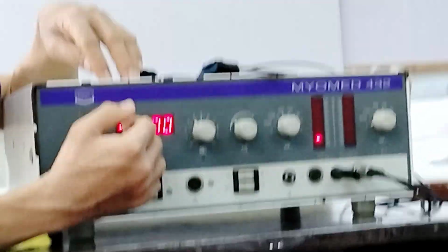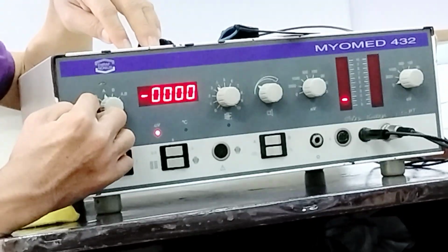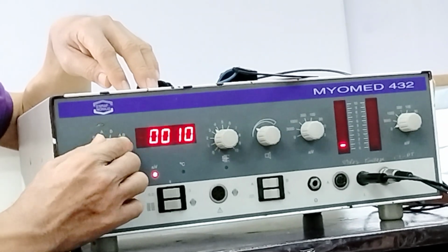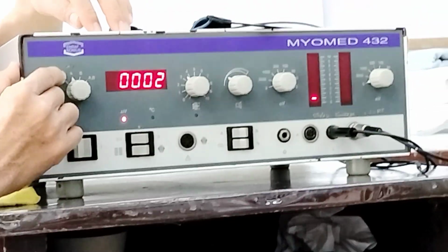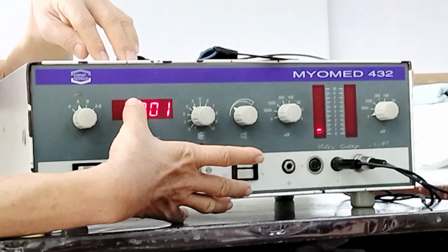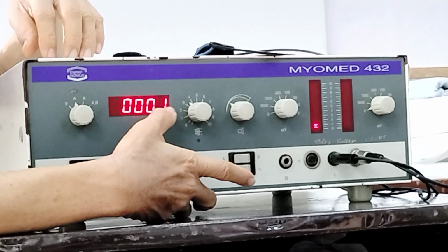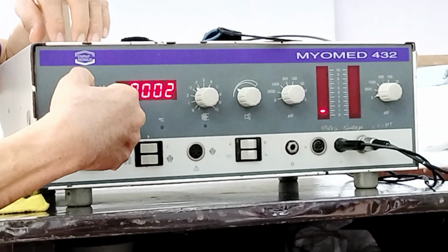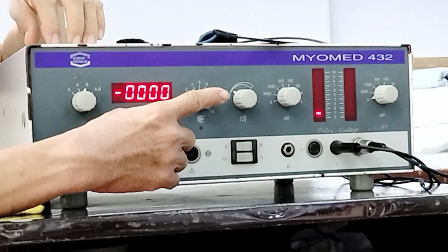So, in relation to that, this will be your selector knob. If you place this to 0, nothing will display. If we place that to channel A, whatever signal is received on channel A will be displayed. There are 2 channels here. So if there is a signal from the channel A electrode, it will display the value here. If it is on B, it will display the value received on channel B.